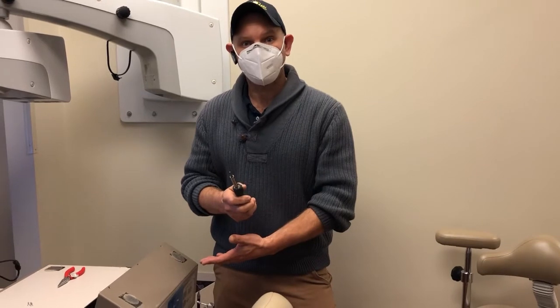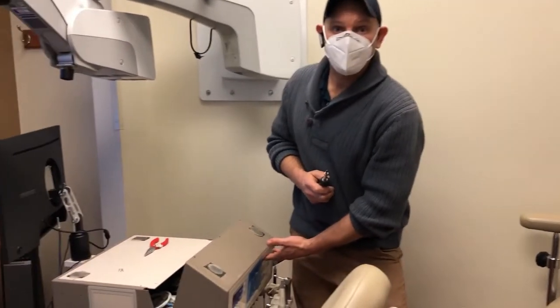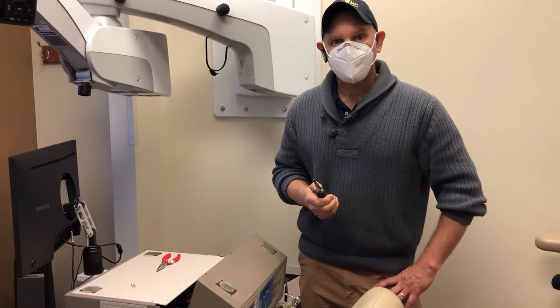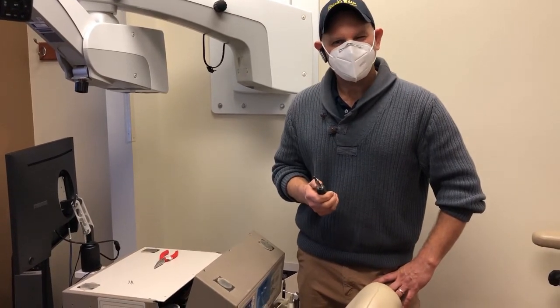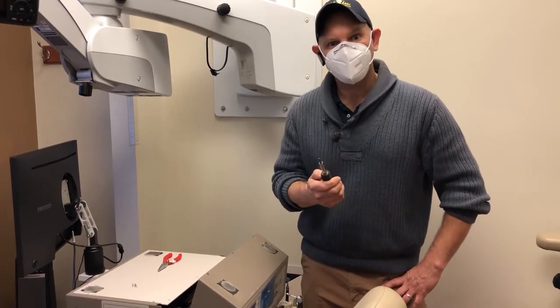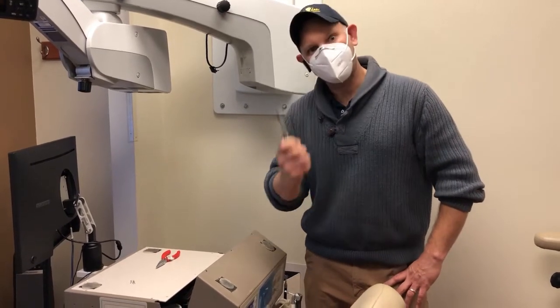When repairing the ASI Dental Cart today, we just replaced the display and on that display there are some very small nuts that are a little bit difficult to get to. With this tool we can go ahead and pull those off pretty easily. Let me show you how.